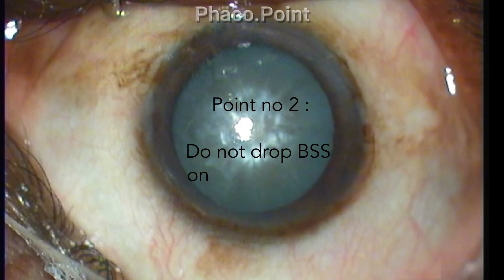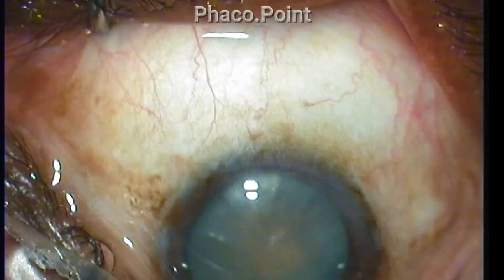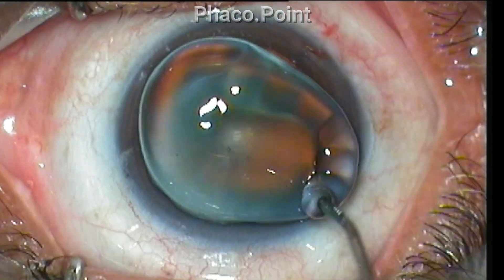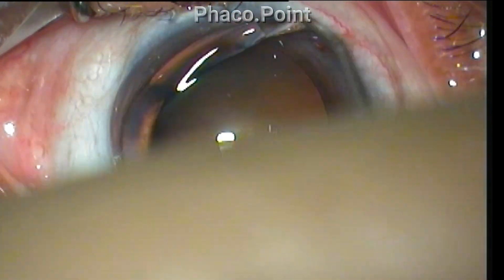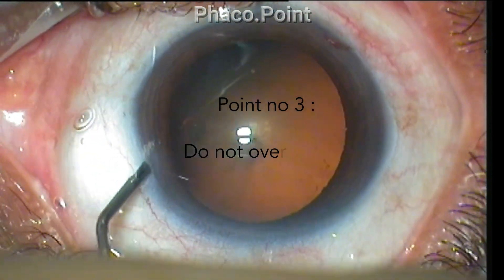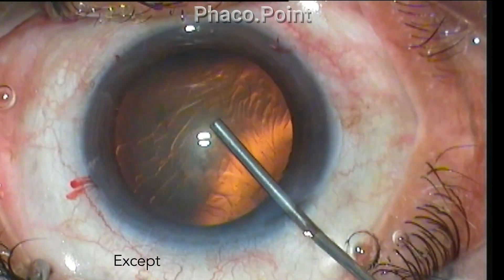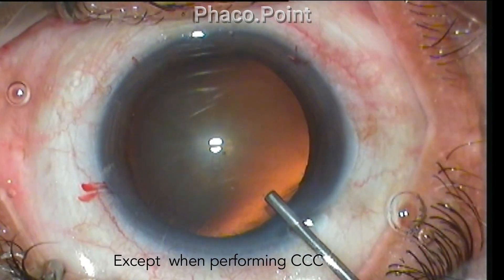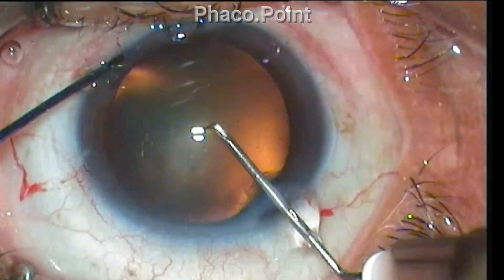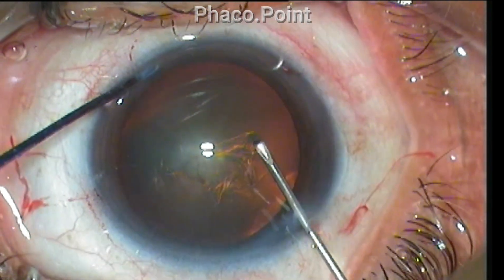The second important point: do not put drops of BSS on the cornea to moisten it. The patient feels the drops and this will elicit a squeezing response. Instead, gently apply viscoelastic over the surface of the cornea to moisten it. Point number three: do not overfill the anterior chamber. There are only two exceptions — during capsulorhexis, where a well-formed anterior chamber is needed to flatten the anterior capsule, and during intraocular lens implantation.